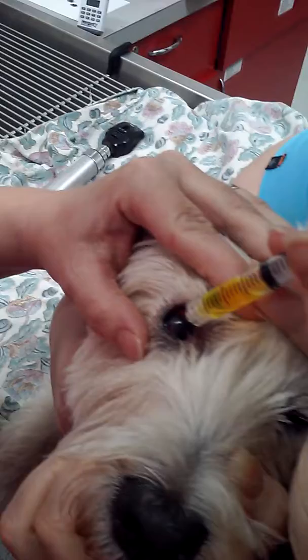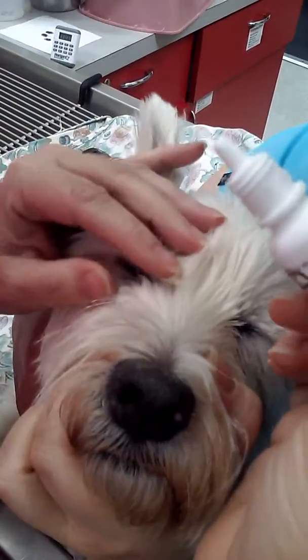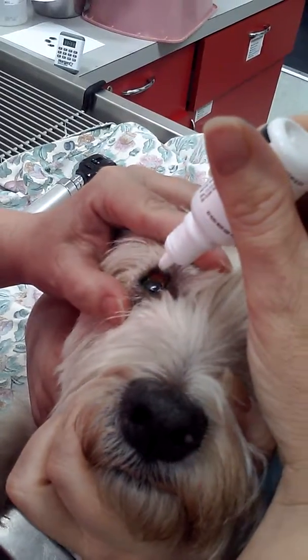So we're going to go ahead, open his eye, and instill one drop, and then we're going to go ahead and allow him to blink. Then we're going to go ahead and rinse out the excess.